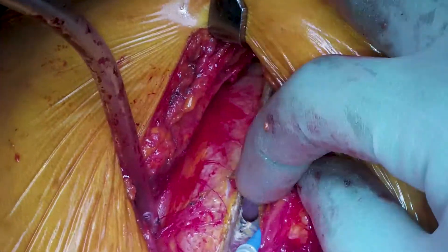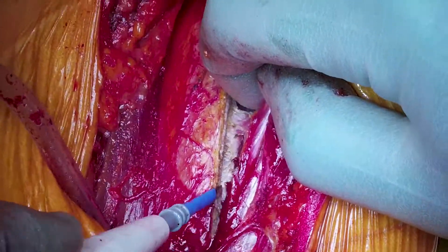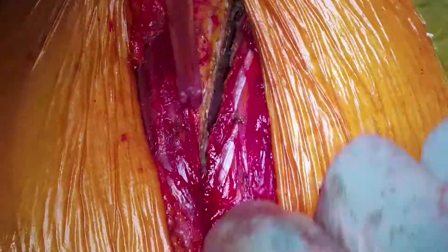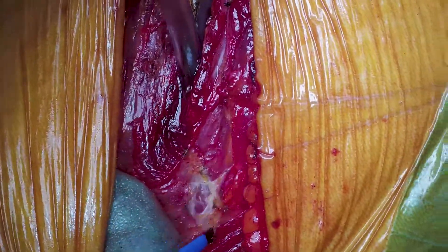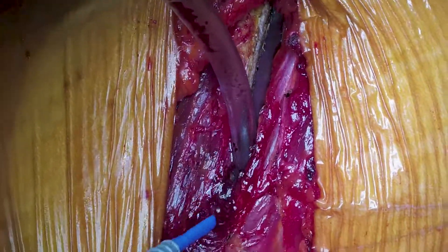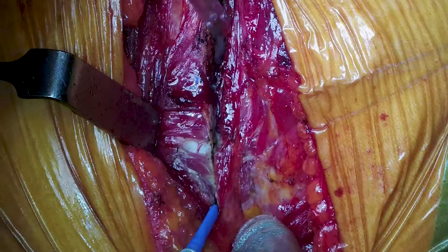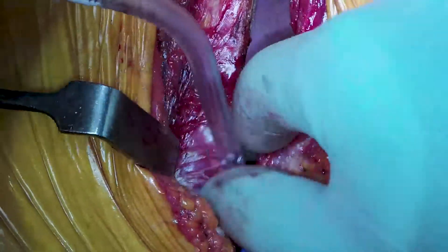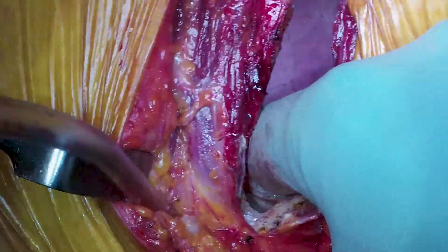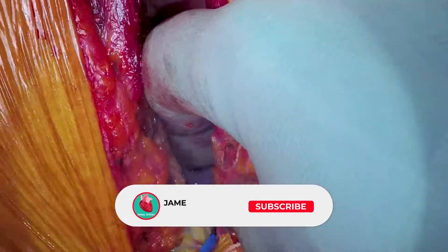Once through the internal intercostal muscles, you can go through with your finger — you can see the lung poking out underneath — and use your finger to help dissect the pleura, which guards against any diathermy burns. Mr. Dunning is now making the intercostal space as large as possible, dividing fibers as far posterior and anterior as possible. He mentioned he doesn't worry about hitting the internal mammary artery because he always leaves a bit of pleura at the bottom, giving enough leeway even when the ribs angle upwards.